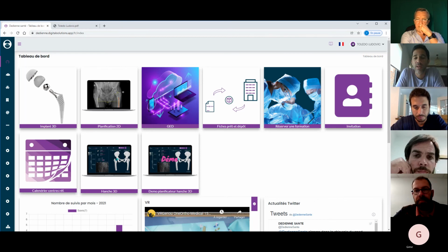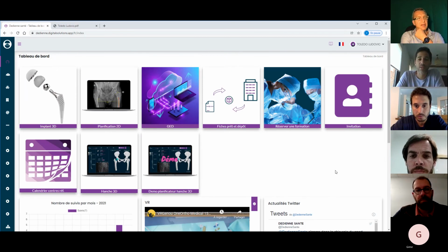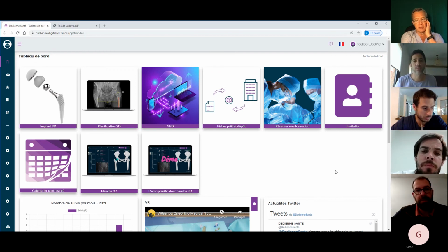It will be nice to have the possibility for me to log in, of course. Francisco Silvestre also. Yes, all the emails you want, we can use them. As Ludovic told us, it's free, and we want as many users as we can. But we always need to be online for the digital preoperative planning. That's fine. Yes, you need to be online.